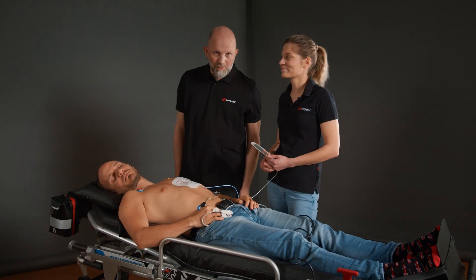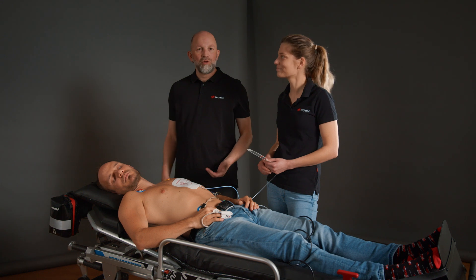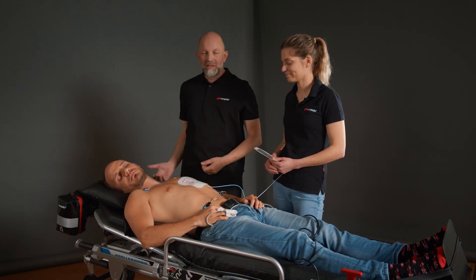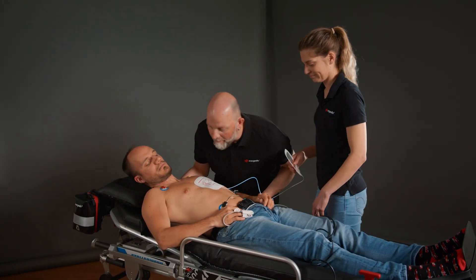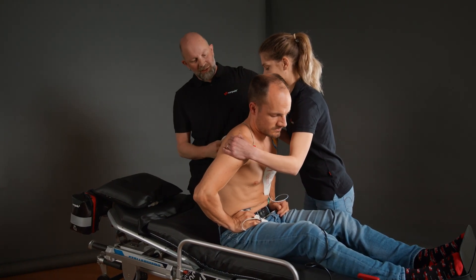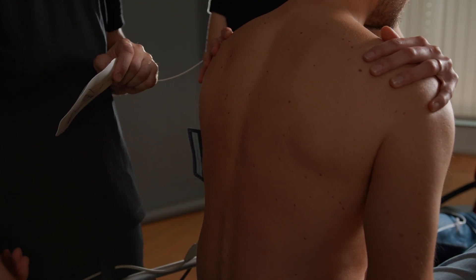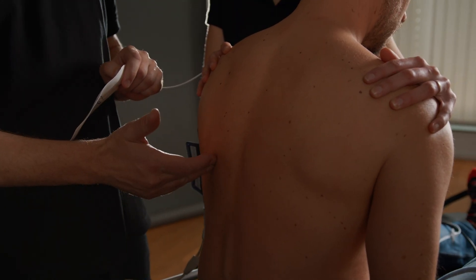To position the rear electrode, we first have to gain access to the patient's back. One option here is to lay the patient on their side or, as we've decided to do here, sit the patient upright. Verena, will you take over please? The lower edge of the shoulder blade to the left of the spine serves as a reference point for the rear electrode.